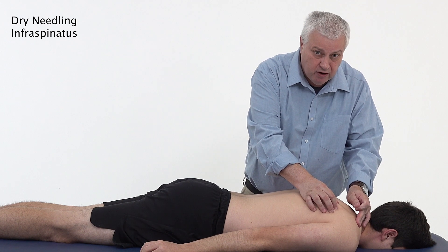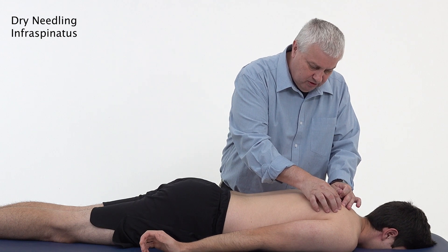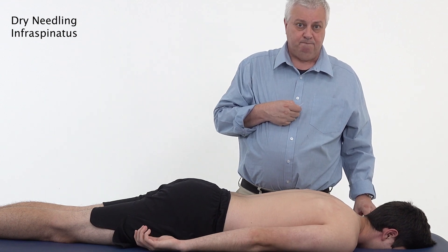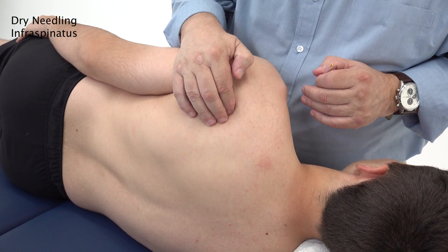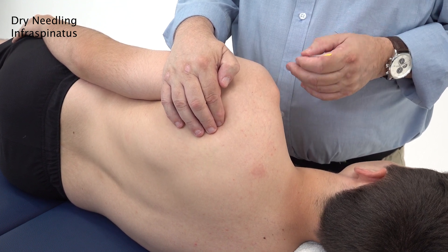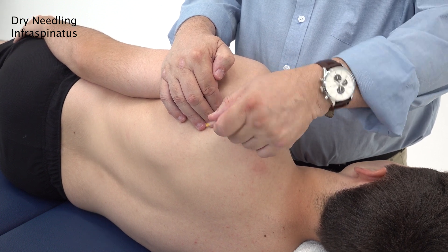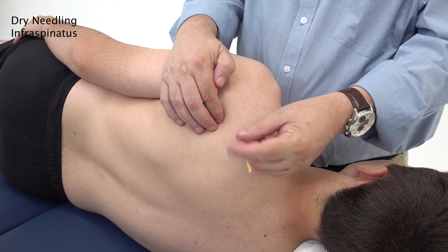Use a shallow angle, locate the spine of the scapula, and insert the needle. Get the patient to turn their hand, find the infraspinatus, and needle using a pincer grip into the infraspinatus. The patient can be prone or side lying. Sometimes it's easier to have them side lying because it lifts the body up and is a little easier to work with. Also, when prone and attempting tangential angles, there is a tendency to go in a posterior to anterior direction - you're less likely to do so if side lying, as you'll be running along the side of the scapula.